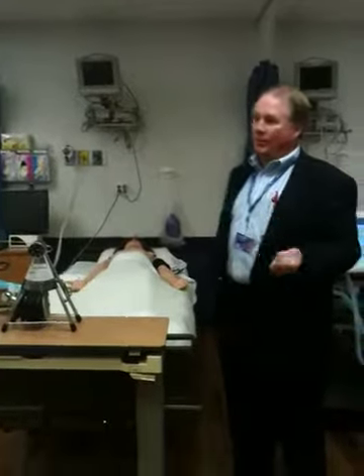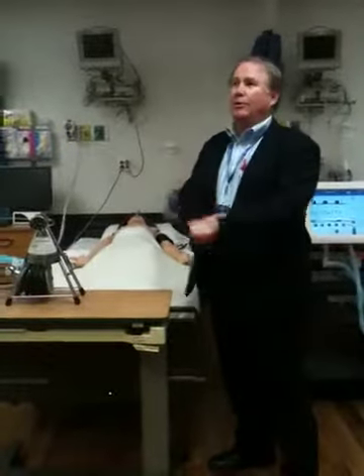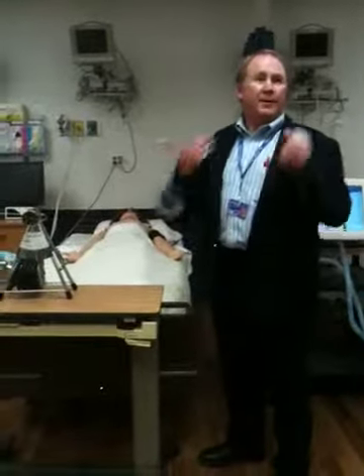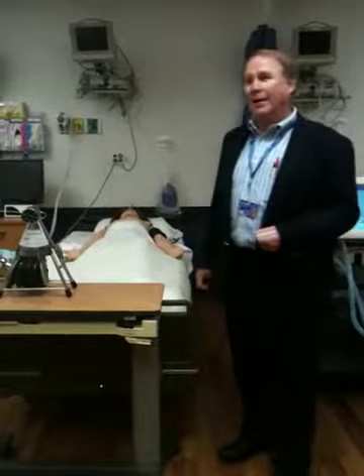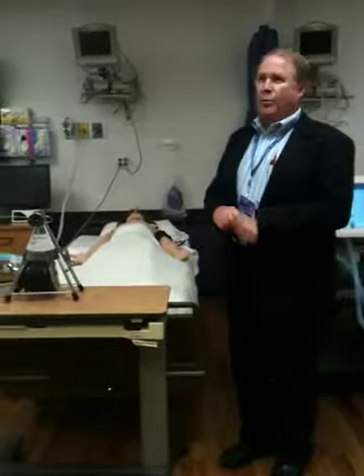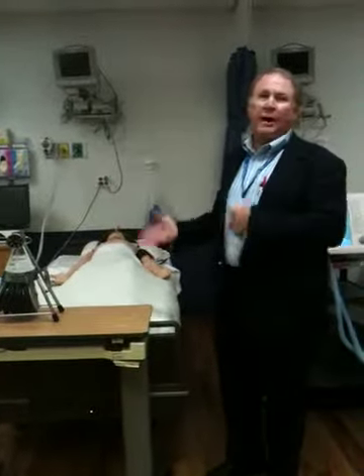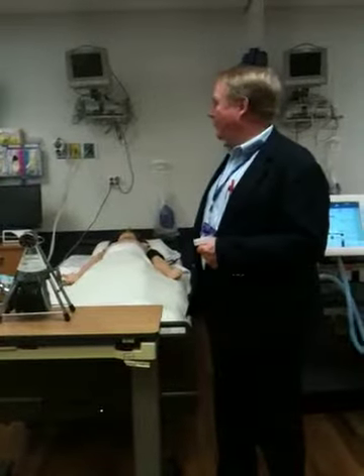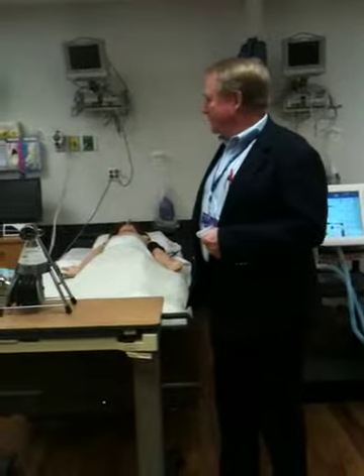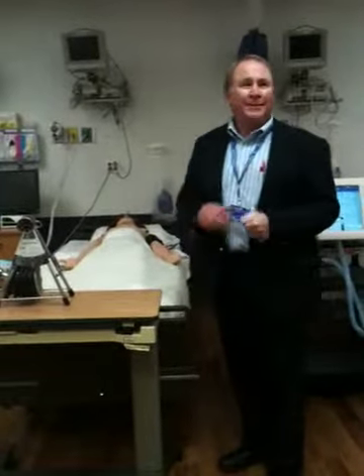When that happens, the blood pressure also changes. If your blood pressure drops suddenly, you lose it on the radial, but you've still got it in the femoral and the carotid. It has heart tones. There are about 25 different heart sounds, murmurs and so forth that will simulate different conditions, whether it's right, left, mitral, aortic, different gallops and so forth. They'll also stick out their tongue, and they can throw up.